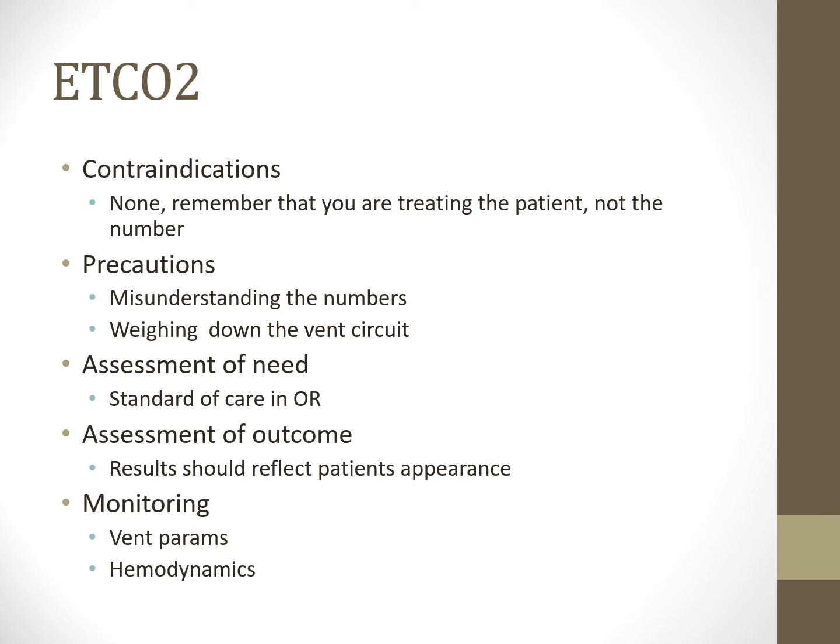Assessment and outcome should reflect the patient's appearance. So that means if their blood pressure was low, and we gave them fluids, or we gave them a pressor, or we gave them PRBCs, we should see the end-tidal CO2 actually start to come back up because we had an increase in perfusion. Increased perfusion means there's more blood working its way back to the lungs, which means more CO2 can be eliminated. So that's something where their minute ventilation may not change, and yet their CO2 is actually climbing, but that's actually a good thing.